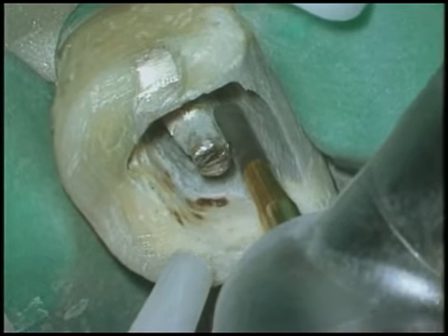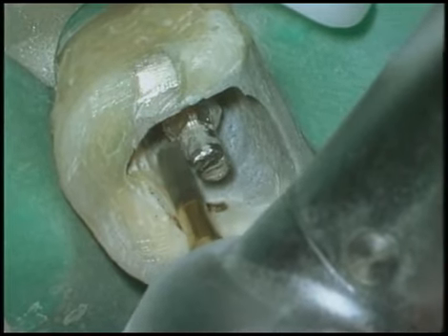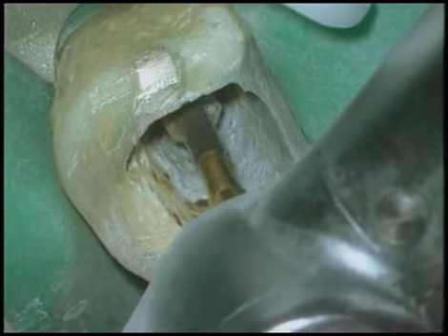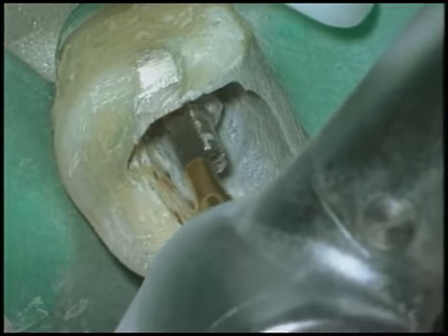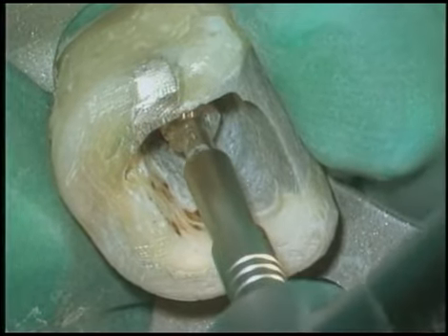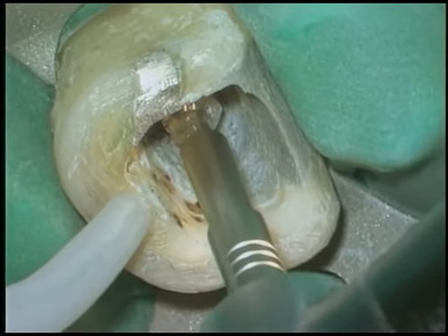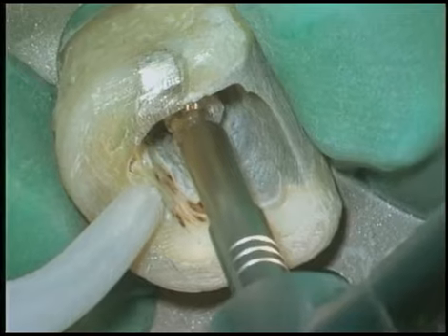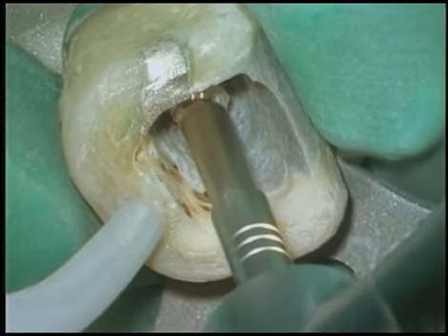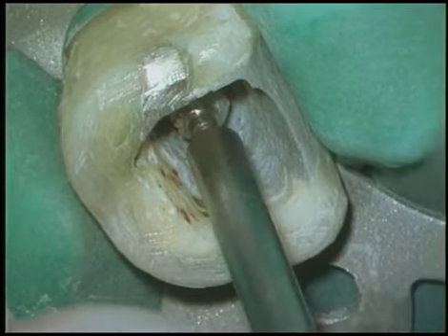This will reduce a lot of the trauma of using the trephines and prematurely wearing them out. Notice as we work around the post, metal to metal, we're very steady. Use your off hand, the thumb, and support the head of the handpiece. The machined down post now can receive the appropriately sized trephine. Use a slow speed, high torque handpiece. In kind of a pumping action, we can very easily now mill down the reduced post and make it very round.